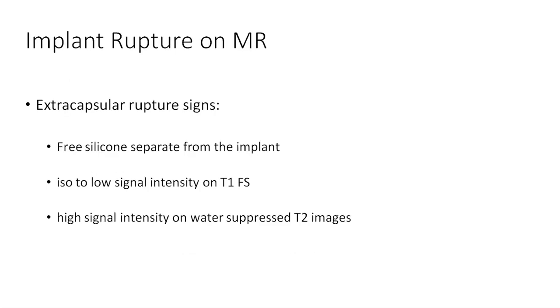Let's talk more about extracapsular rupture signs on MRI. We can see free silicone separate from the implant. We can see iso to low signal intensity on the T1 fat sat images outside of the capsules. We see high intensity on water suppressed T2 images outside of the capsules as well.